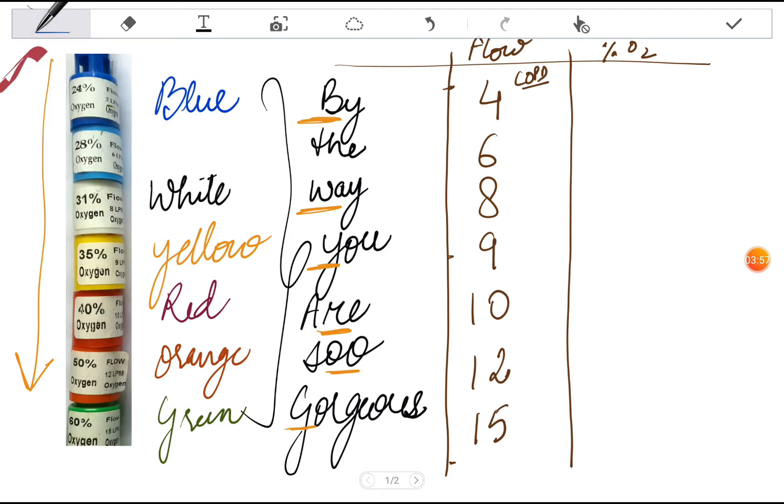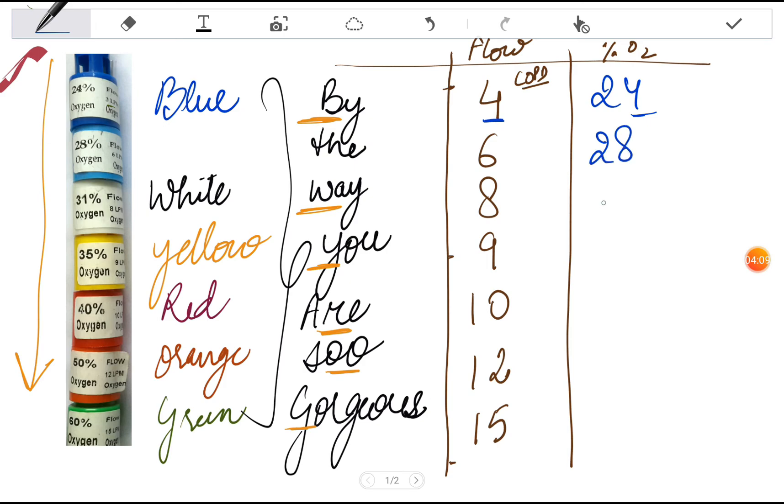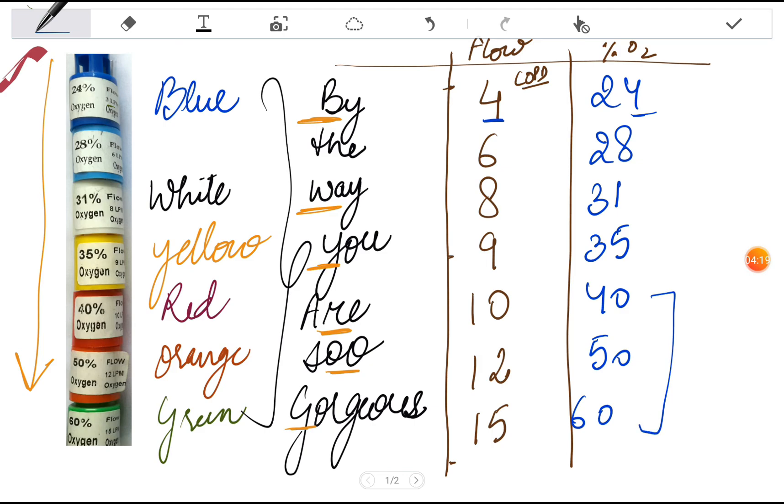The percentage of oxygen delivered is: first is 24 percent, then 28, 31, 35, 40, 50, and 60. You can remember easily - first two are in the digit of 20, and then of 30.